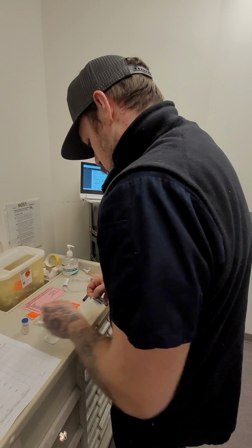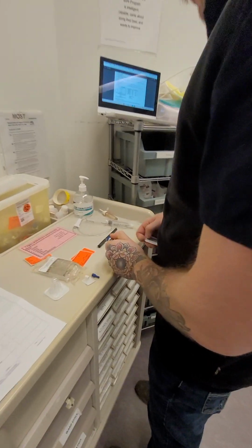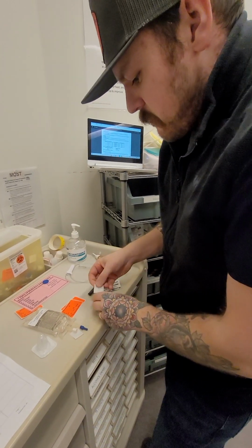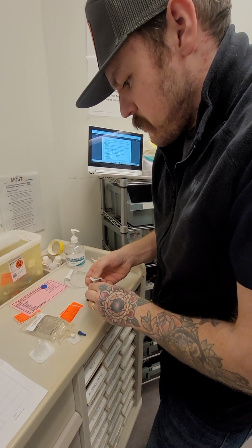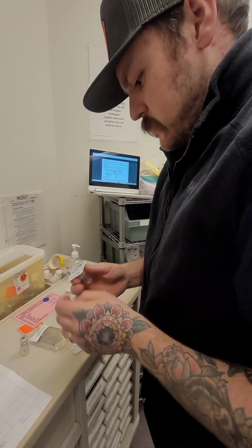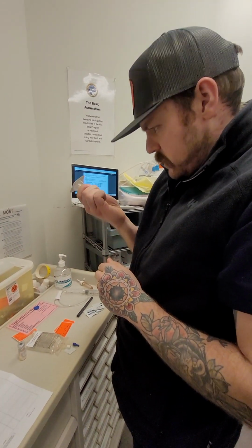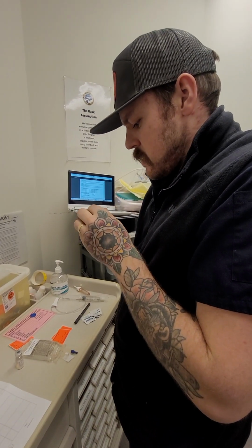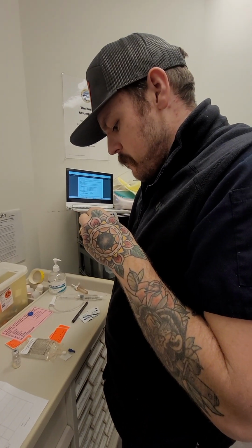We've got another alcohol swab here, and I'm going to get this ready. So we're going to pop that top. And we're going to give this clean 15 to 30 seconds. Let that dry for 15 to 30 seconds. Next, we've got a reconstitution device. So hold this and look for the loose end. It should be right here.